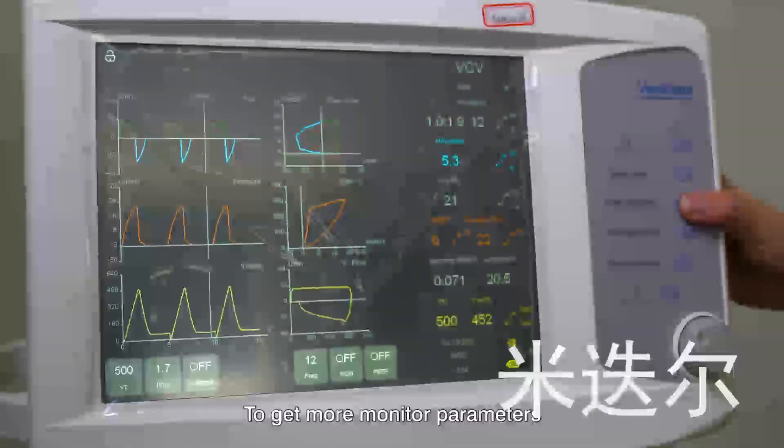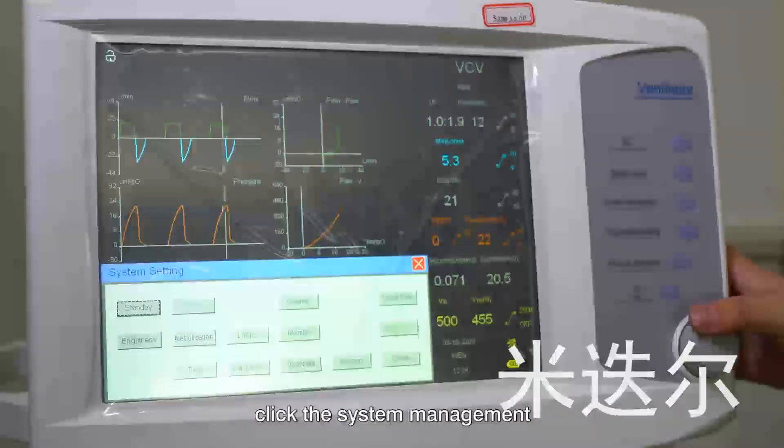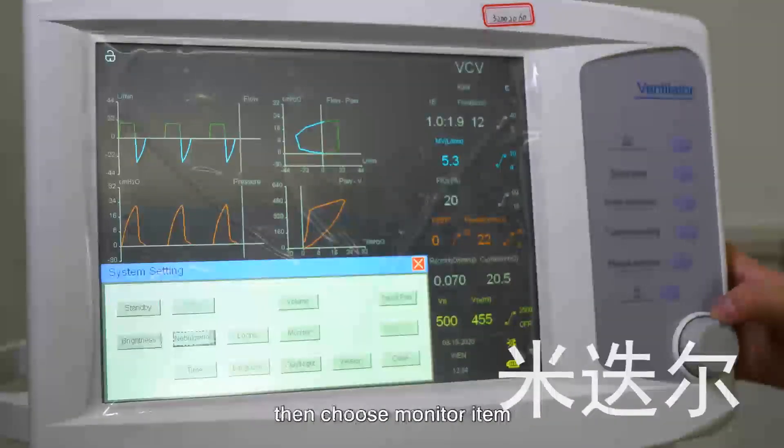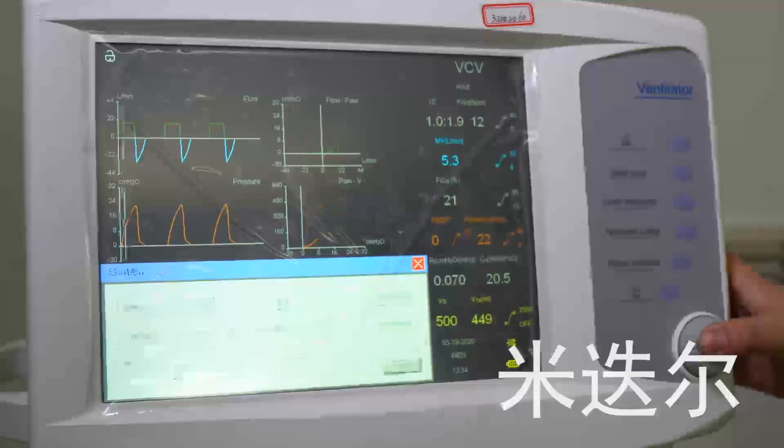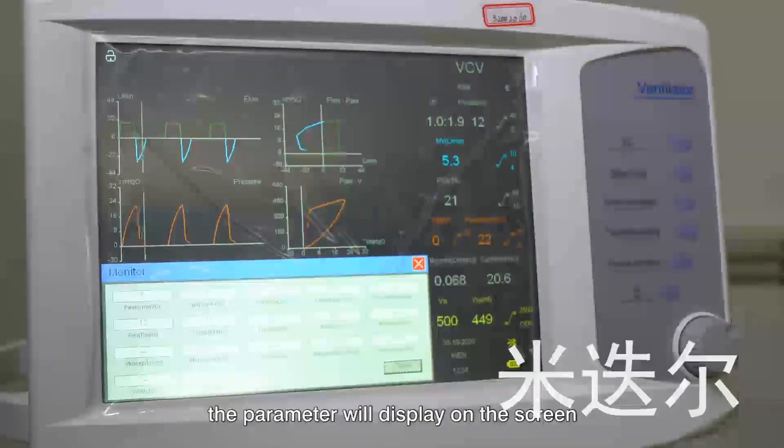To get more monitor parameters, click the system management, then choose the monitor. The parameters will display on the screen.